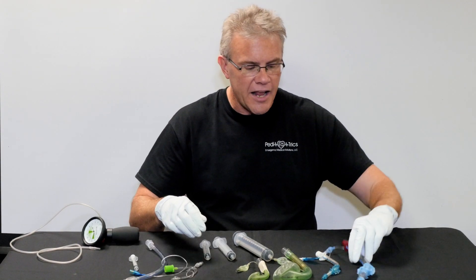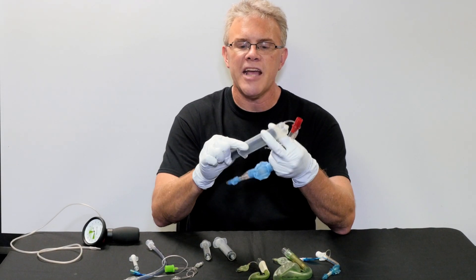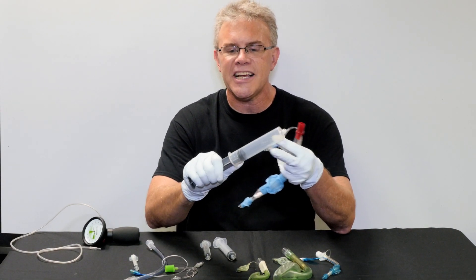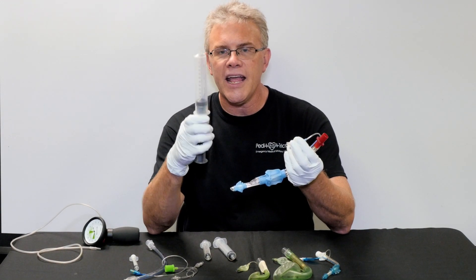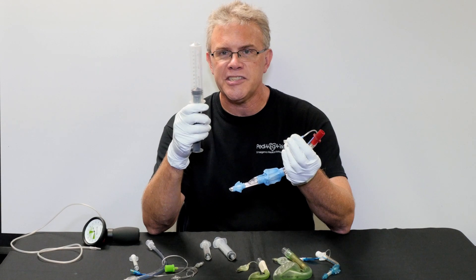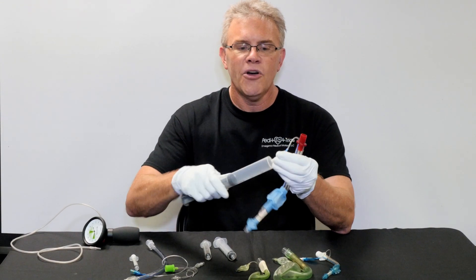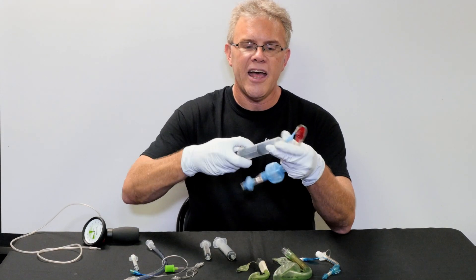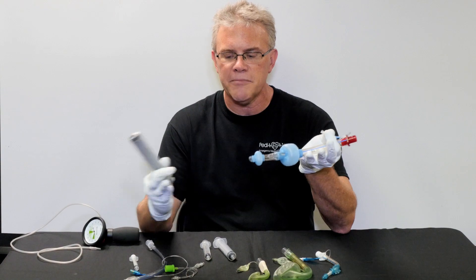Versus if you've got a big King Airway and you know it's going to take 50, maybe even 60 CCs to inflate, go ahead and hook up a 60cc syringe and pull it all the way back to 60. Hook it up, and then when it inflates, you're set with the correct amount of air.